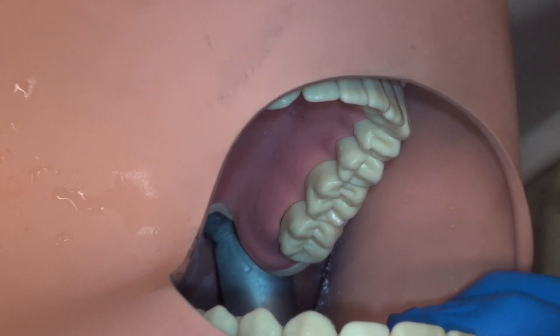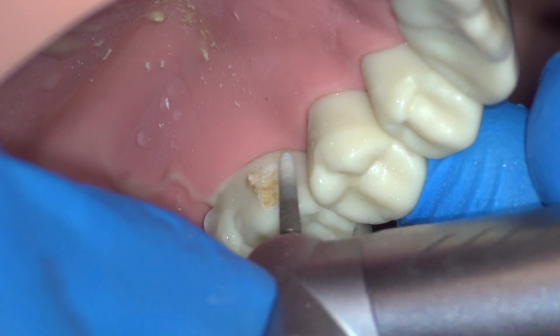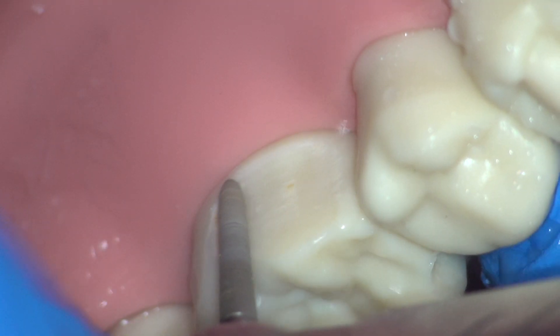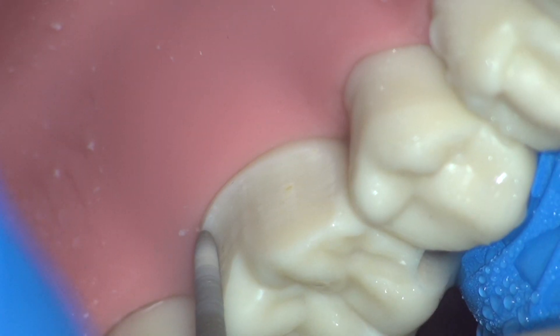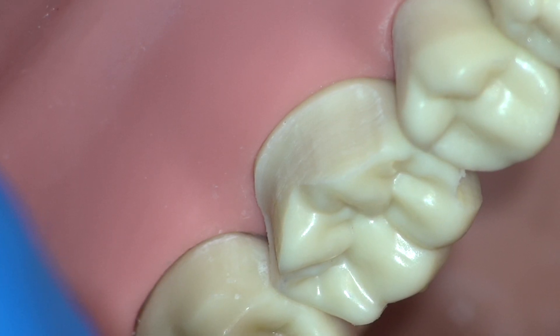For the next step, lingual reduction, we turn the patient's head to the right. Select the desired angulation and continue placing the finish line in a systematic manner from mesial to distal. Ensure placement of the finish line in the desired ideal location. We do not want to have to repeat steps. The quickest way to finish a crown prep is to only do it once. Complete the lingual reduction before moving to the next step.